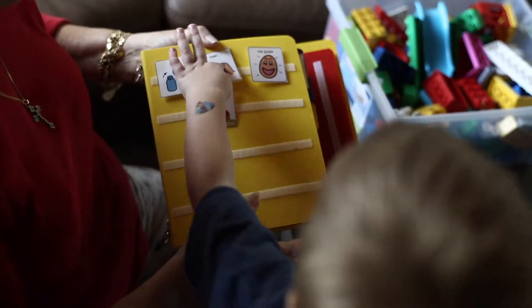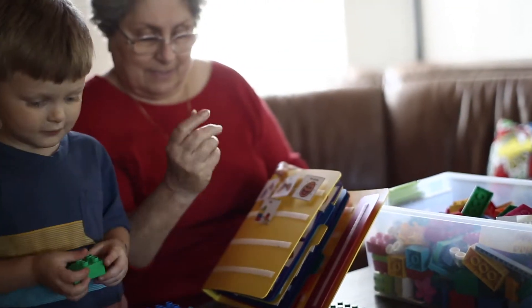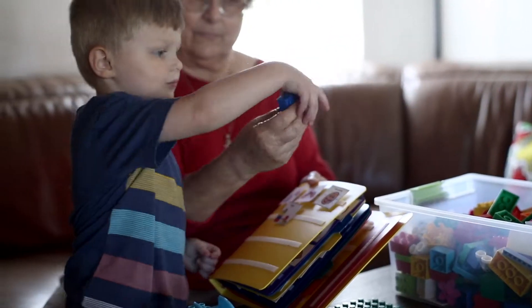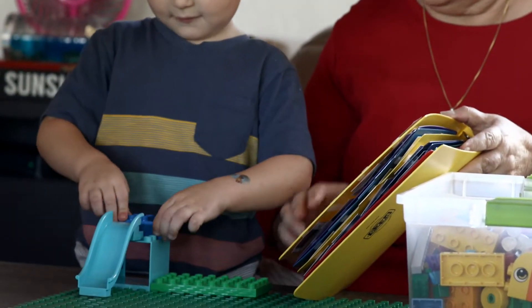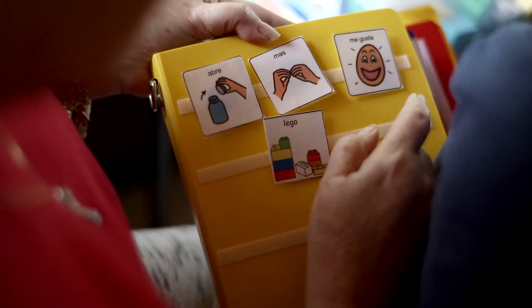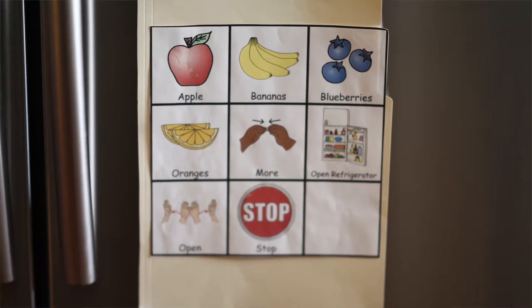Dylan repeatedly uses "More!" during the Lego activity with his grandmother, demonstrating intentional communication. Having a visual display of options can certainly help your child make choices.